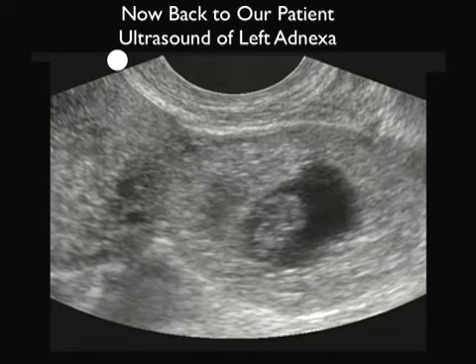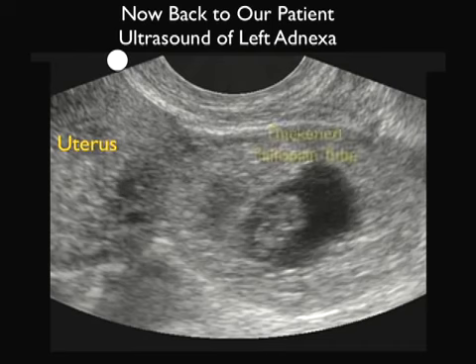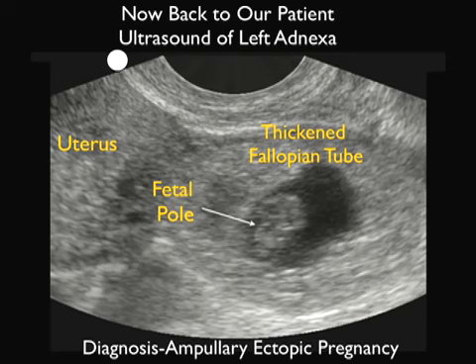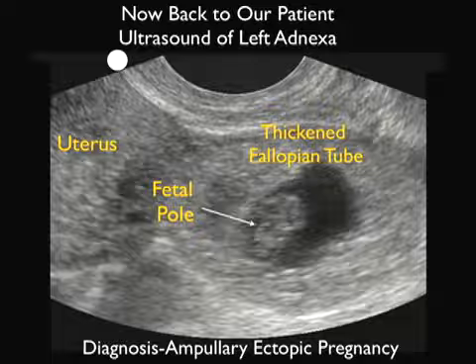So we'll go ahead and freeze that, and we see again the uterus towards the midline, the thickened fallopian tube out towards the left adnexal region, and within the thickened fallopian tube, the presence of a fetal pole, making the diagnosis of an ampullary ectopic pregnancy. So our next move was to call OB-GYN stat for a consultation. In conclusion, the final diagnosis in this case was ectopic pregnancy.